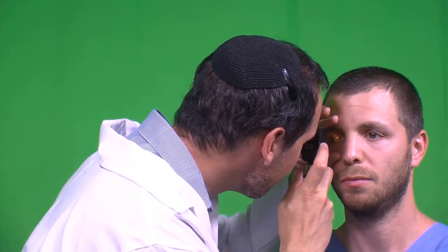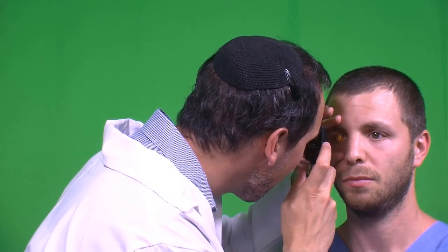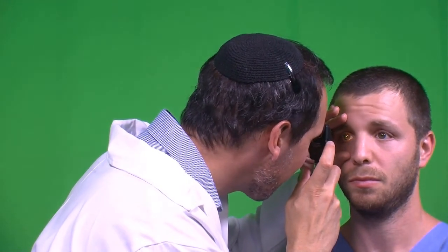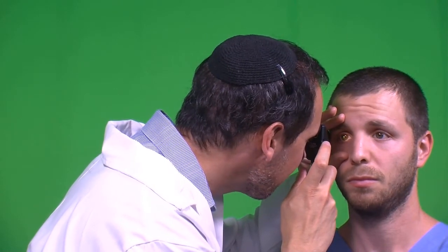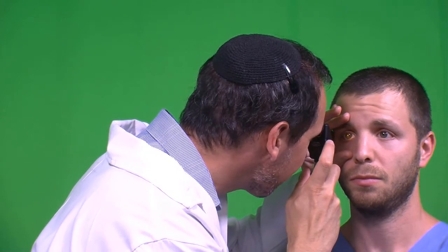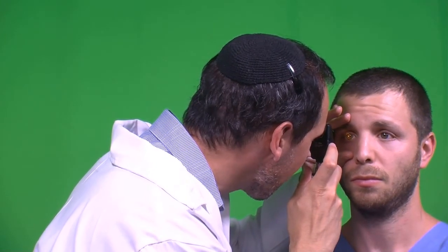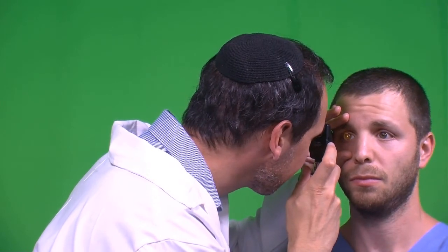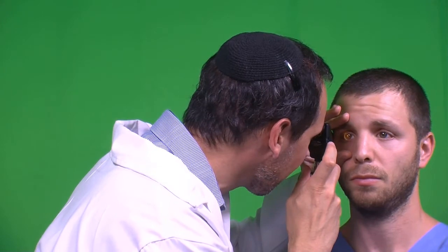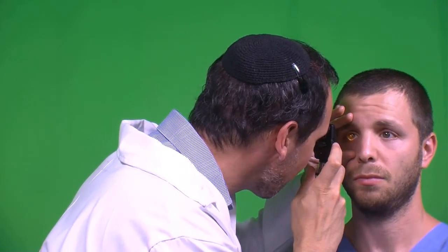The next thing I'm going to do is try to focus on the optic nerve. And in order to do that, I'm going to focus nasally. And that means moving myself out a little bit laterally until I see the optic nerve. I'm then going to fine-tune my focus again until I see the borders of the optic nerve as clearly as I can. And then I'll proceed to assess the qualities of the optic nerve, such as its color, the borders, and the quality of the vessels.